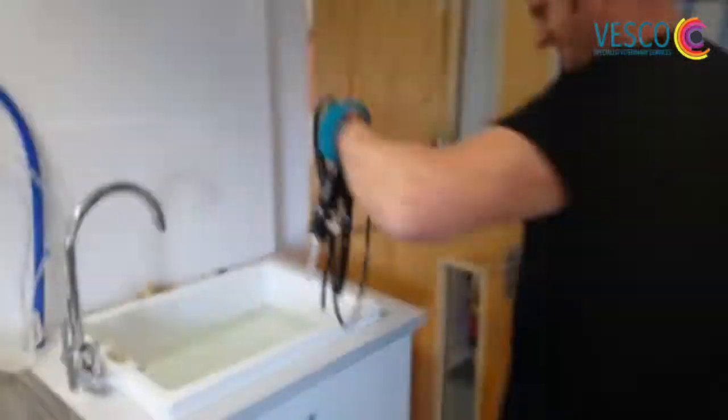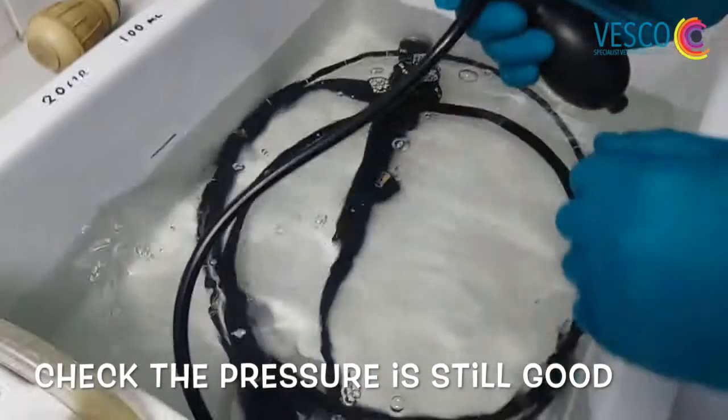I can take it to the sink. The pressure is still stable. Keep the leak tester out of the sink and now take my irrigator.